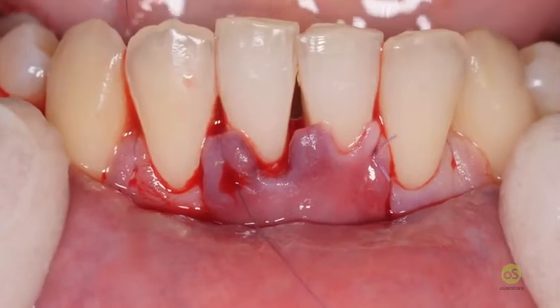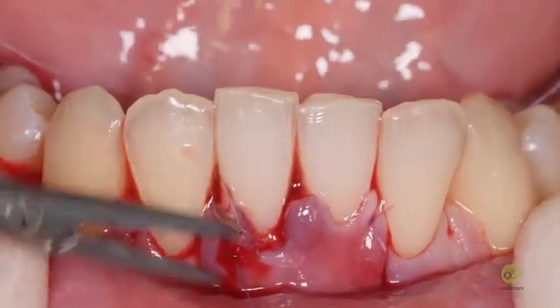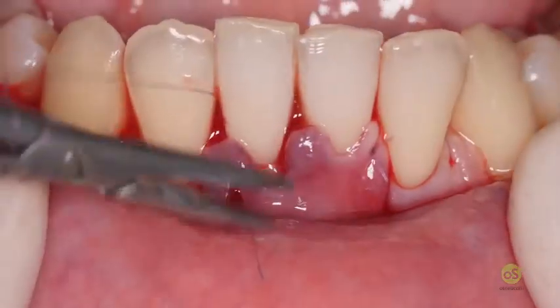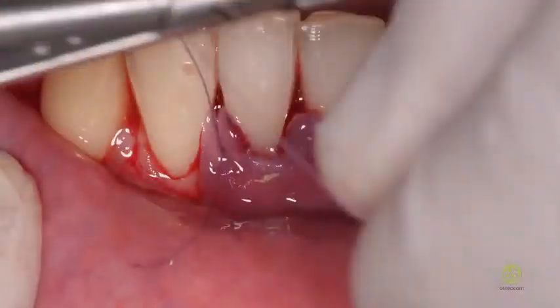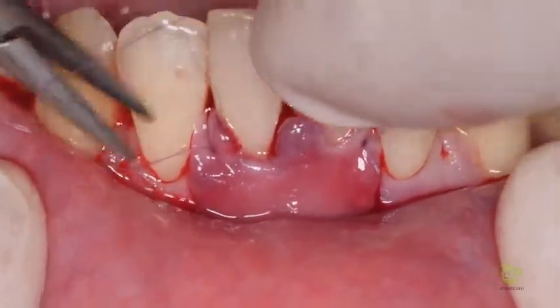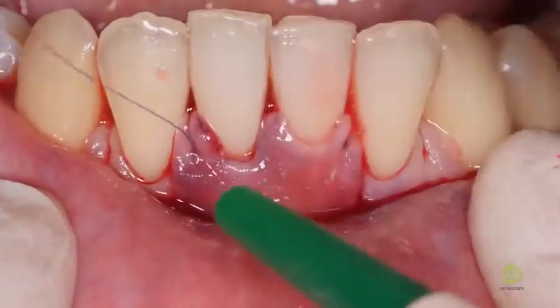Now I go back to the starting point below the contact area, and again I will close this second papilla, trying to make this compression in the middle, but without pulling it too much. It's just a positioning of the papilla in the final position that will be done again once the vertical release incision is closed. And you can see that the interincisor papilla is in the final position.